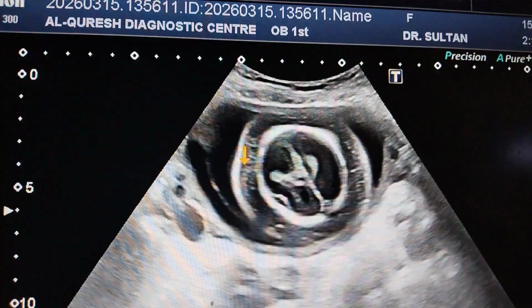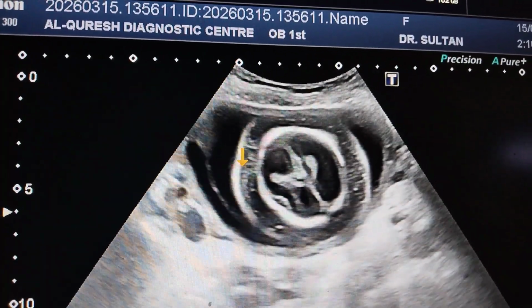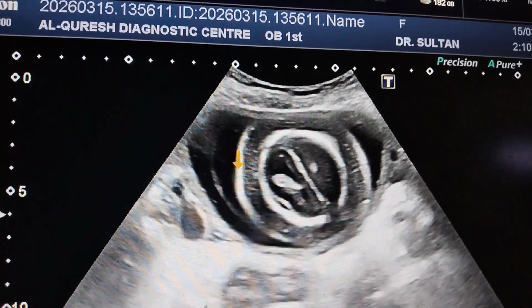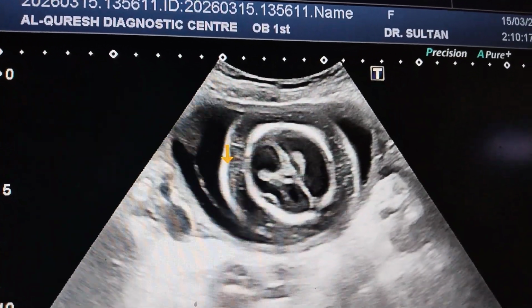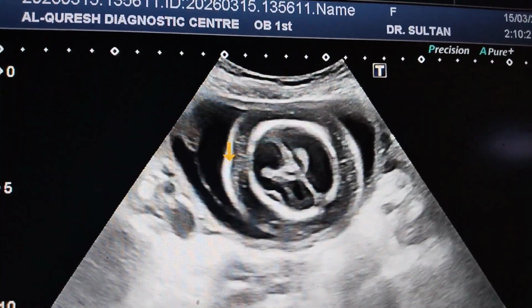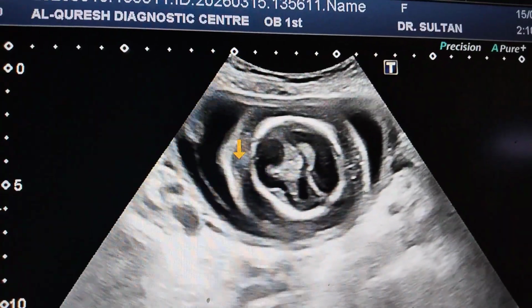But if we talk about the sonographic picture, we should see the cause. In immune, most commonly, the middle cerebral artery will show the high peak systolic velocity, while in the non-immune, it is less common.